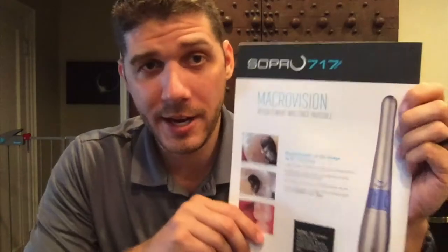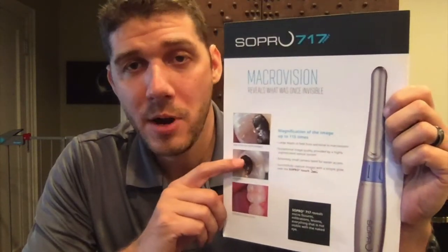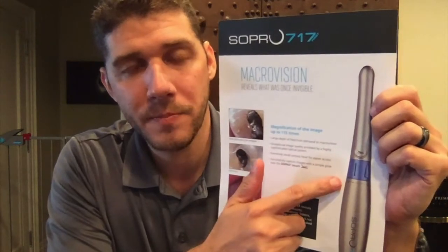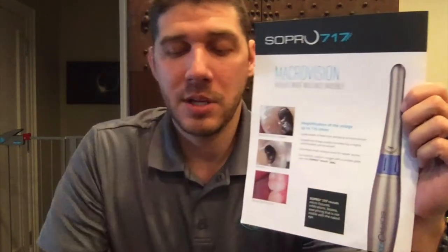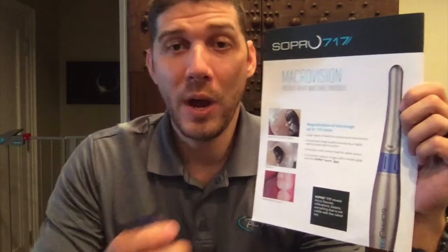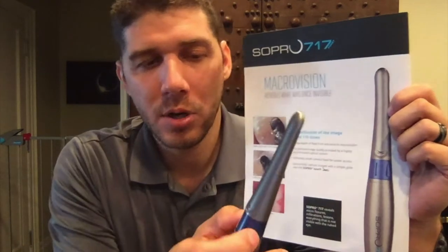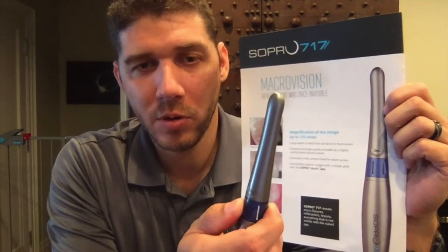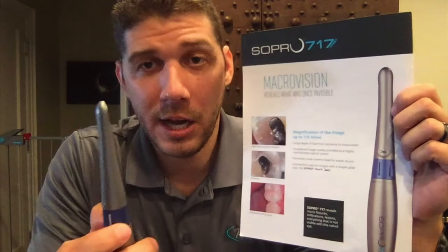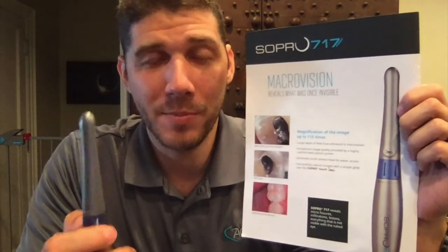The next camera in our lineup is the SOPRO 717. This camera has an adjustable focal ring that gives you the ability to take a full face image, as well as a smile, arch, and single tooth. It also has the ability, by moving the focal ring, to take what we call macro vision — or 115 times magnification.